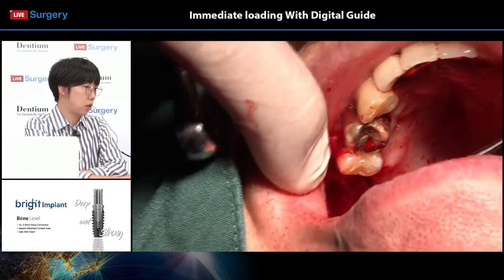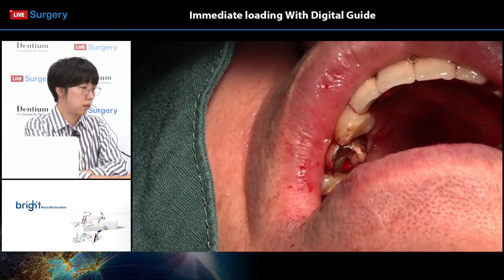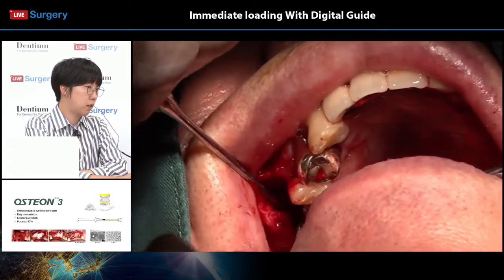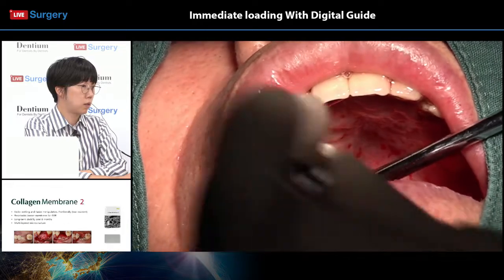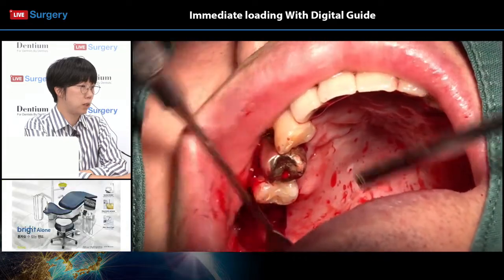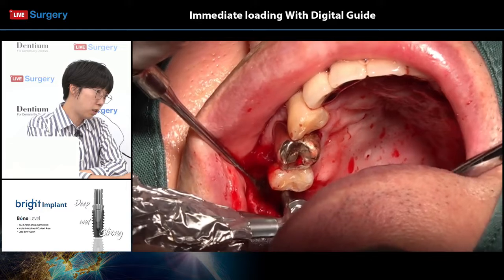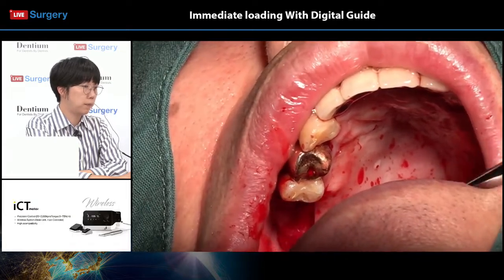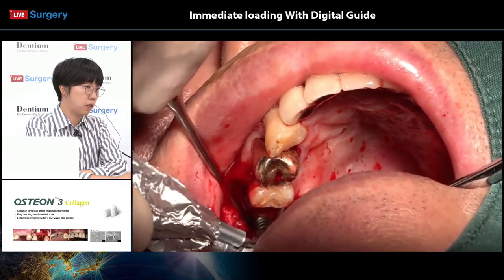If the implant positions are unsatisfactory, Dr. Lee might have to make some adjustments manually. Well, maybe there is some mobility on the implant, or the implant position wasn't in place where he wanted. I think he is taking the implant out using the reverse mode. He has taken implant number 16 out, and number 17 as well.